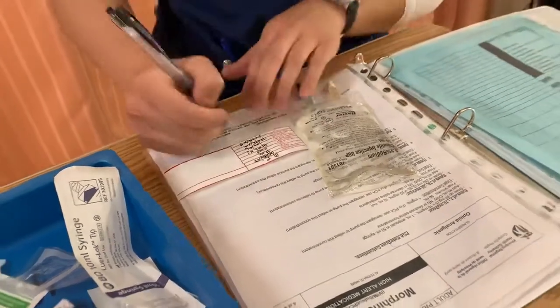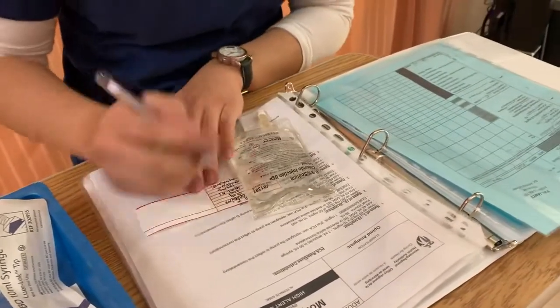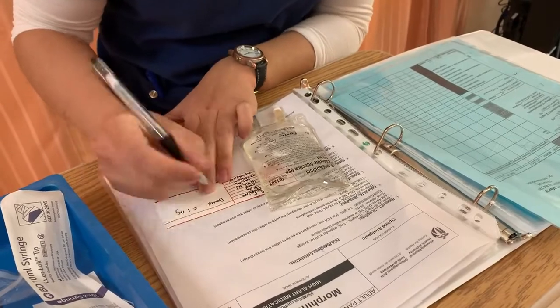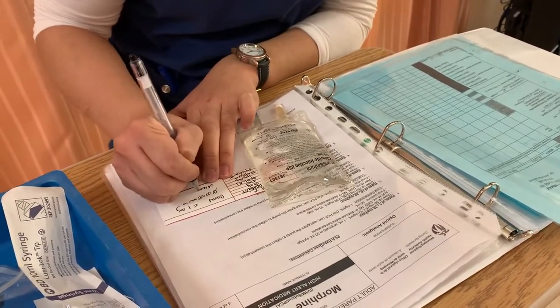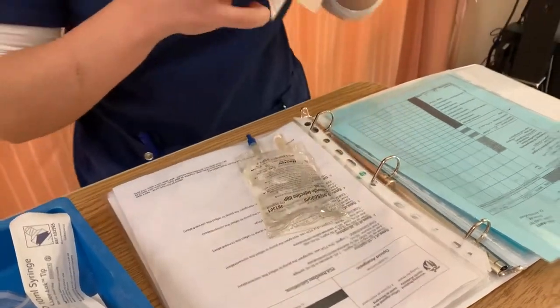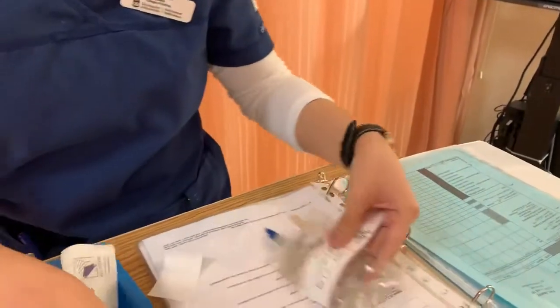We also made sure that according to our MAR right here, our bolus is 1 milligram. There is no continuous infusion for that. And I also checked the lockout, which is 5 minutes. Okay, so now we put that on our bag. There we go. And now we draw up our medication.